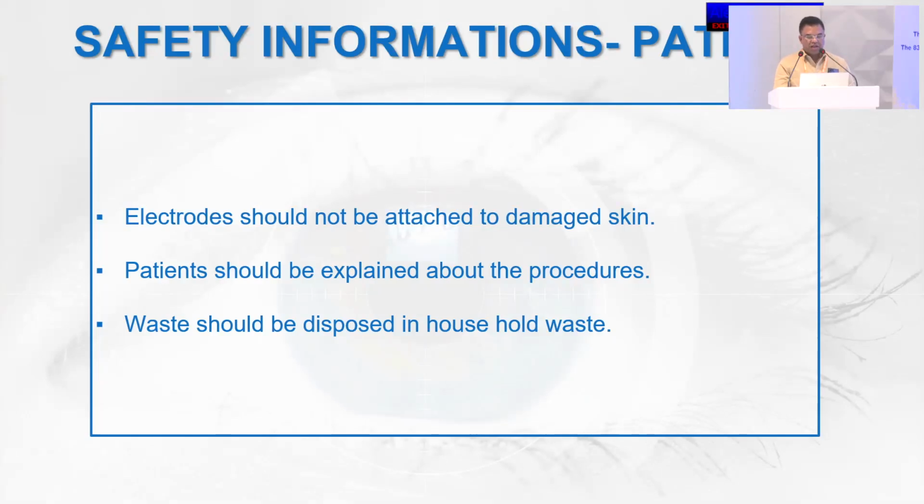For the patient, electrodes should not be attached to damaged skin. The patient should be explained about the procedure, and waste should be disposed of in the household waste.